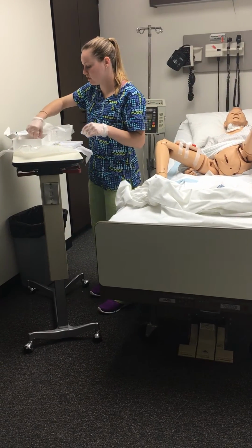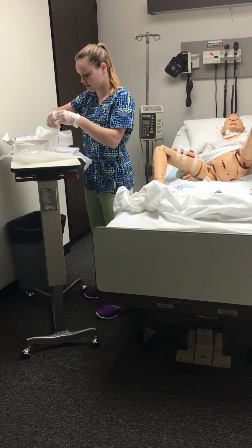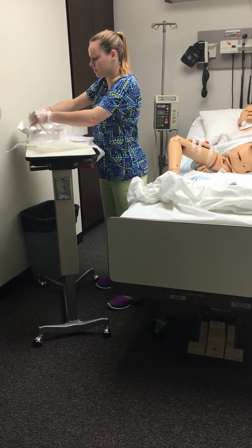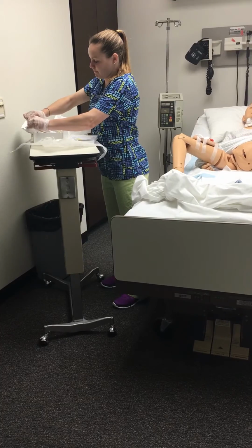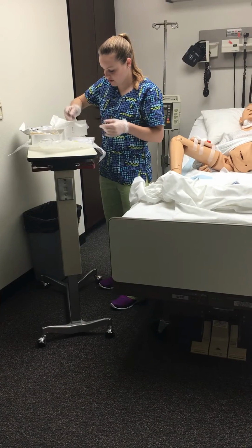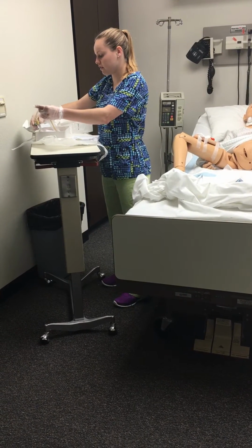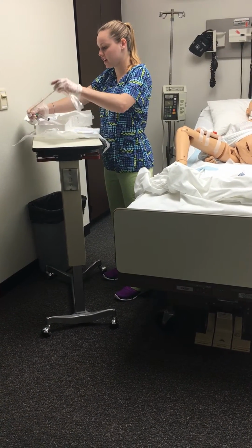And then I'm going to connect my water to the lumen of the catheter before I touch the labia, because it is easier to do with two hands instead of one. Okay, now that's in there. And then I would take my lubricant out and I would squirt it right here in order to lubricate my catheter. So I'm just going to really carefully keep this in here. Remove this plastic.